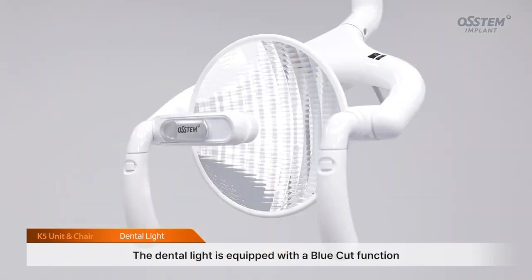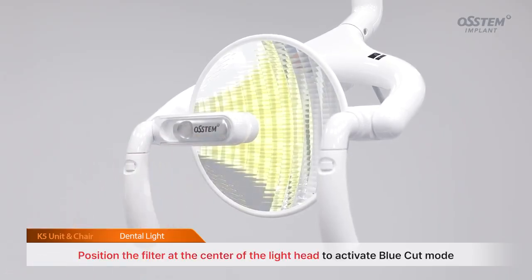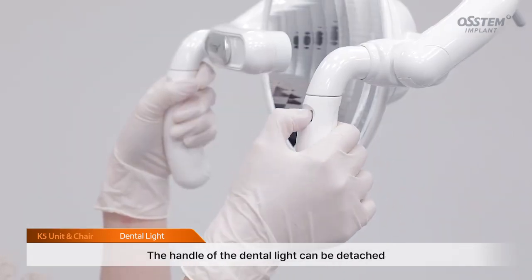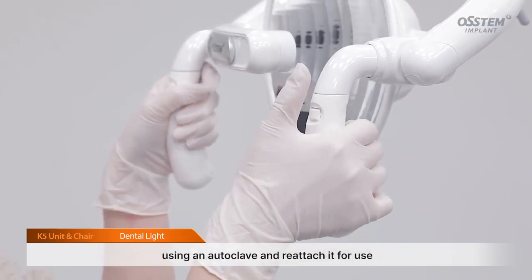The dental light is equipped with a blue cut function. Using the blue cut function reduces the intensity of blue light wavelengths, helping to prevent premature curing of light-cured resin and composite materials during dental procedures. Position the filter at the center of the light head to activate blue cut mode. Move the filter back to its original position to return to normal mode. The handle of the dental light can be detached. After detaching, you can sterilize the handle using an autoclave and reattach it for use.